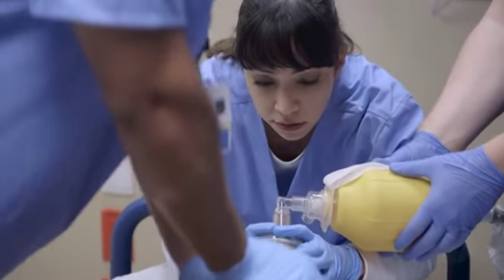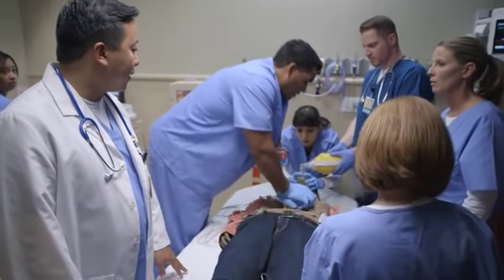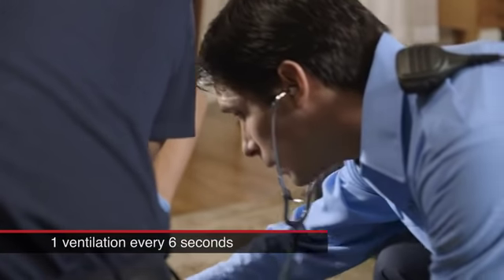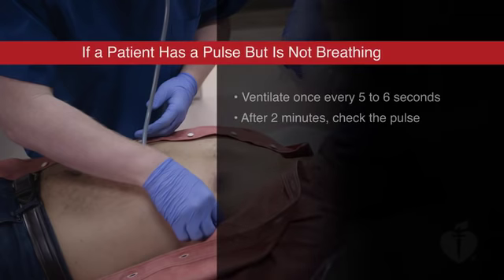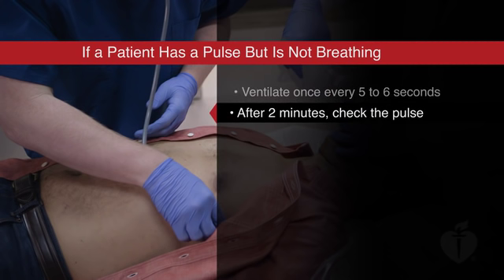Before we get into the specific airway skills, let's review the recommended ventilation rate for cardiac arrest patients. For patients in cardiac arrest, provide 2 ventilations with the bag mask device after every 30 chest compressions. After inserting an advanced airway, healthcare providers should continue ventilations by providing asynchronous ventilations once every 6 seconds. If a patient is in respiratory arrest and has a pulse but is not breathing, ventilate once every 5 to 6 seconds. After 2 minutes, reassess the pulse.